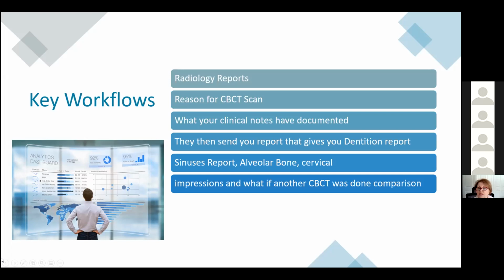But you are responsible for ordering that CBCT scan, whether the patient is in your office and your patient, or that you're using your CBCT scan for actually another business for people to send in patients. And a lot of offices do that.